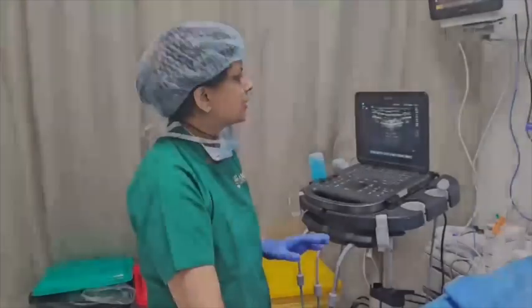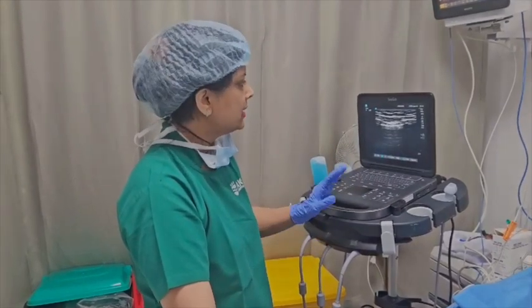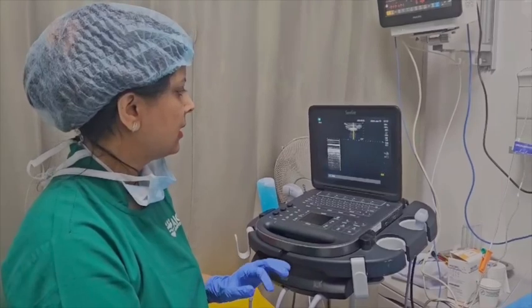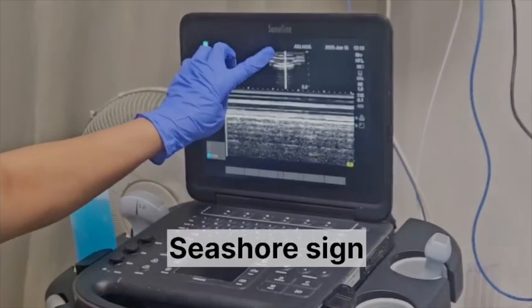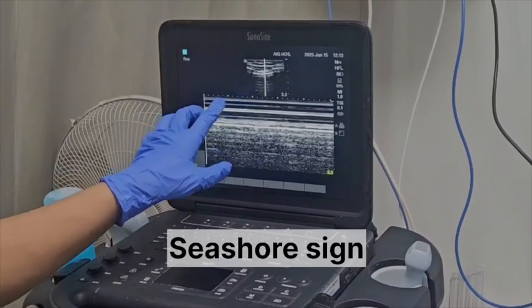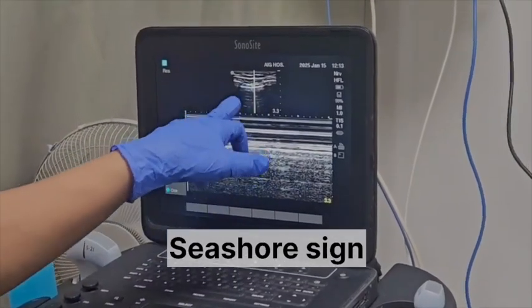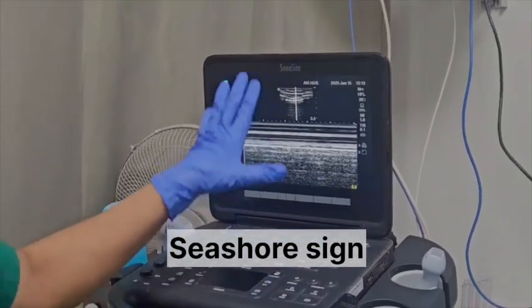The second sign that we see in the normal lung is the seashore sign. For this, we see the pleural line, put an M mode like this, and on the M mode timeline, this is a typical seashore pattern. The upper portion of the chest, that is the skin, subcutaneous tissue and muscular area, being more static, gives a picture of a sea, whereas the more dynamic part, that is the lung, gives a grainy appearance. This is the shore part. So this is the seashore sign.